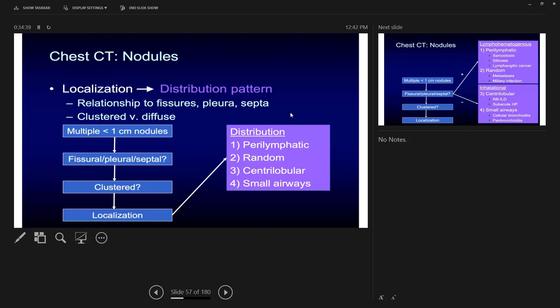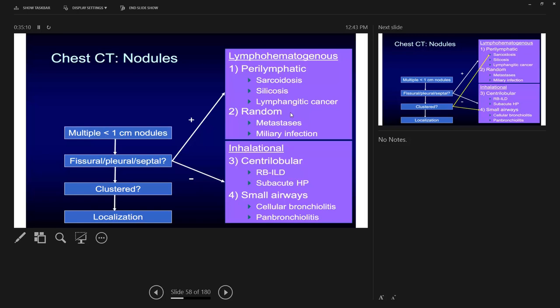After establishing nodularity as the major pattern, you need to further characterize: upper or lower zone, central or lateral, clustered or diffuse, solid or ground glass nodules. The classification follows: perilymphatic (sarcoidosis, silicosis, lymphangitic spread); random (miliary infection or metastasis); centrilobular/inhalational — RB-ILD produces more solid nodules while subacute HP produces more ground glass nodules — both upper and middle lobe predominant.